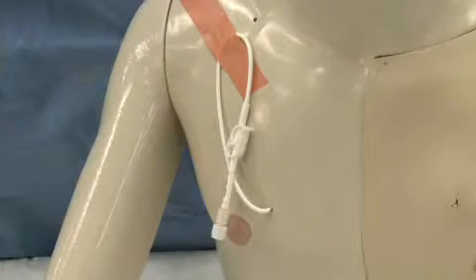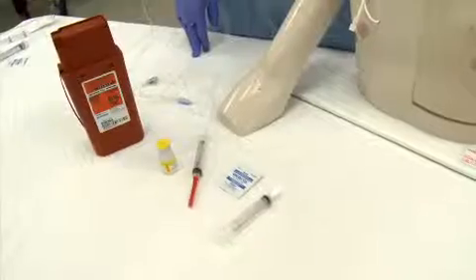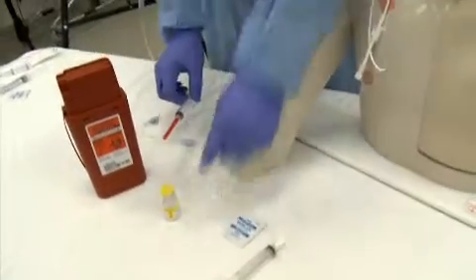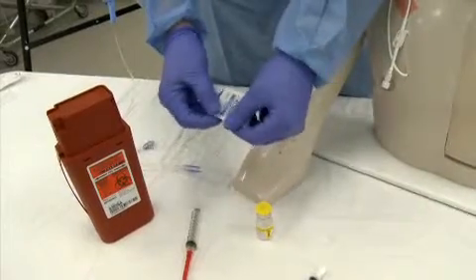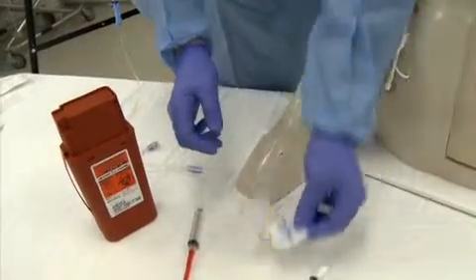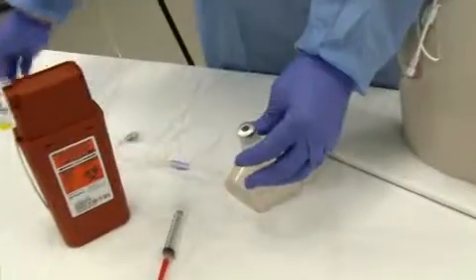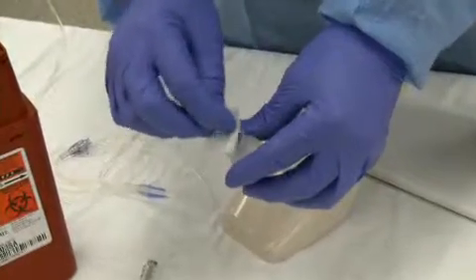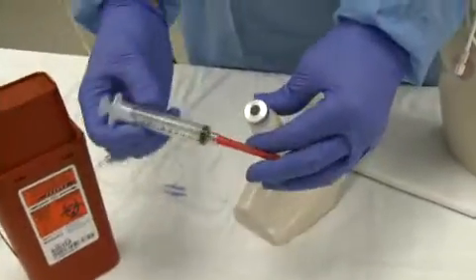The first CVAD access demonstrated here is the Hickman indwelling catheter. For this skill, you will require two 10 cc syringes, one filled with normal saline and one empty, alcohol swabs, a primed IV tubing attached to a fluid supply, and a Sharps biohazard container. Be diligent to use aseptic technique when accessing a CVAD.